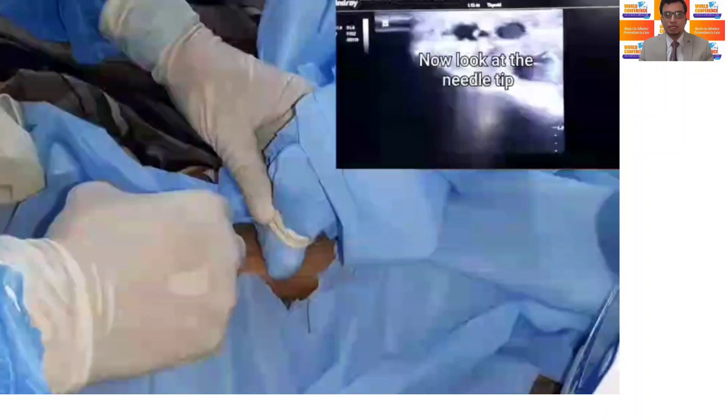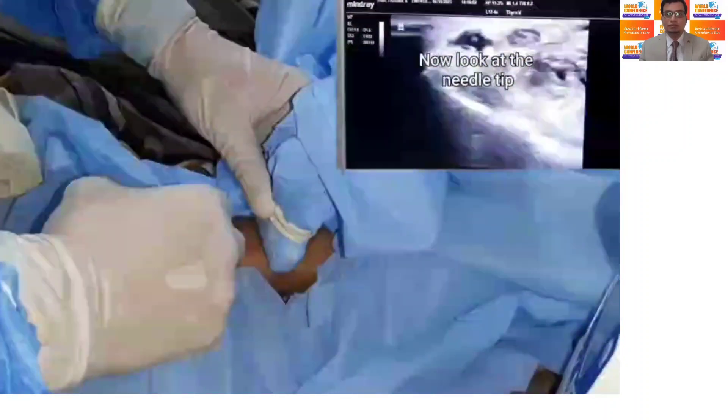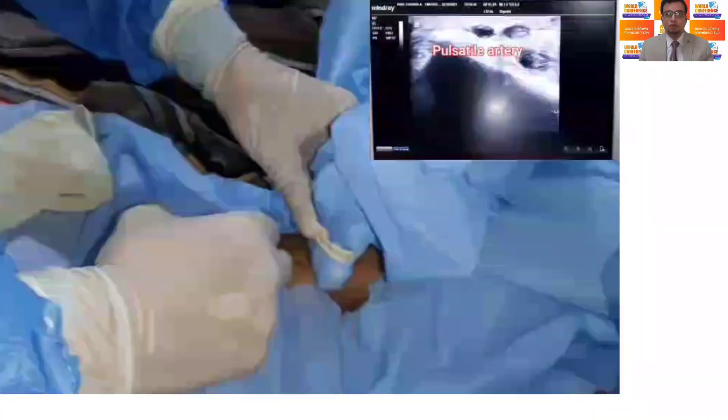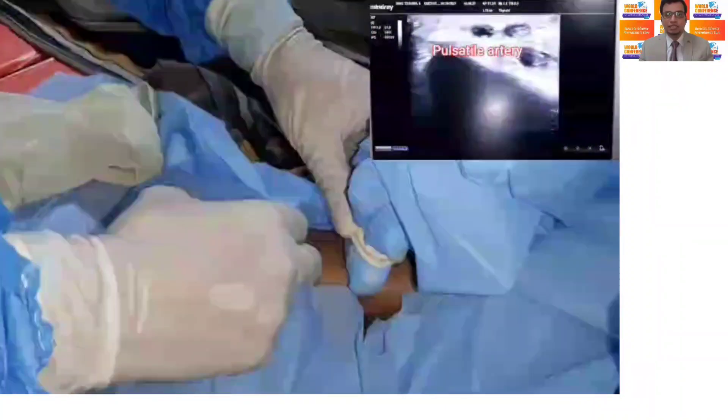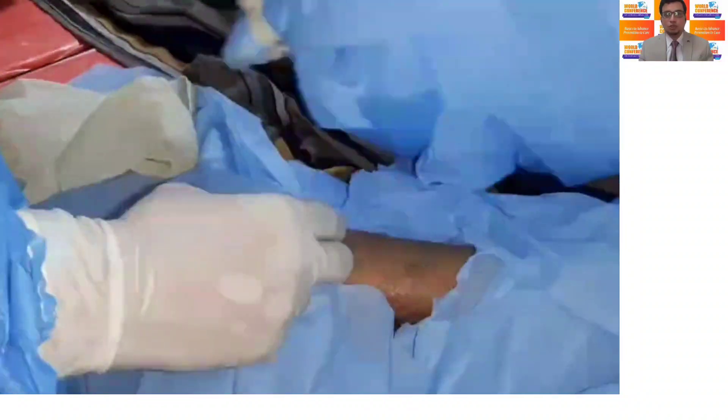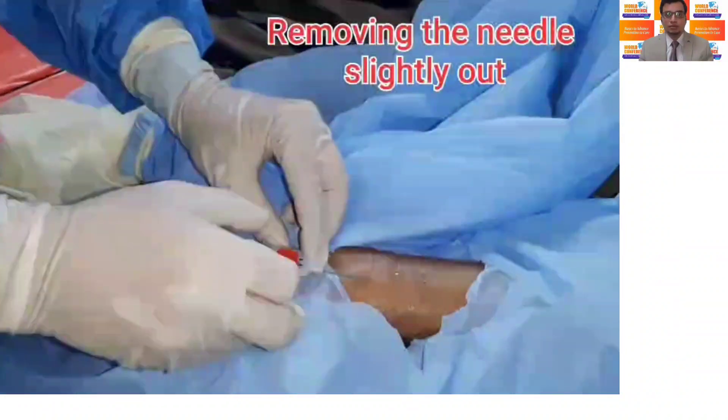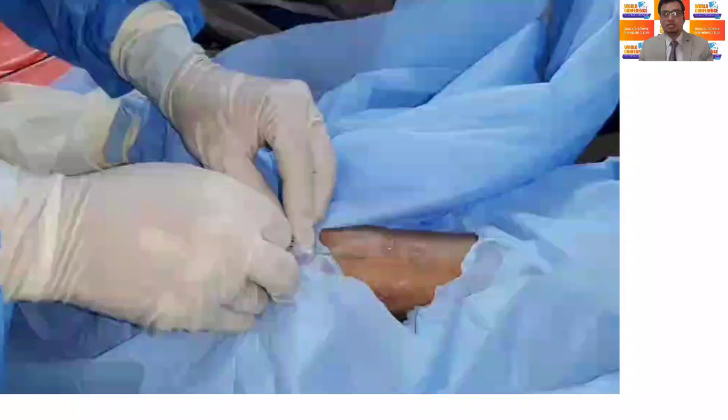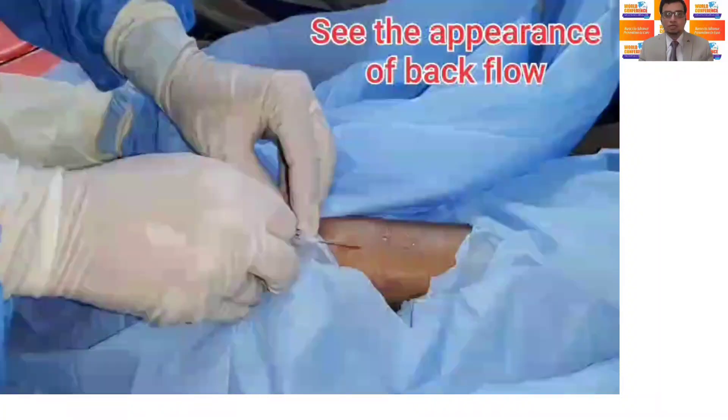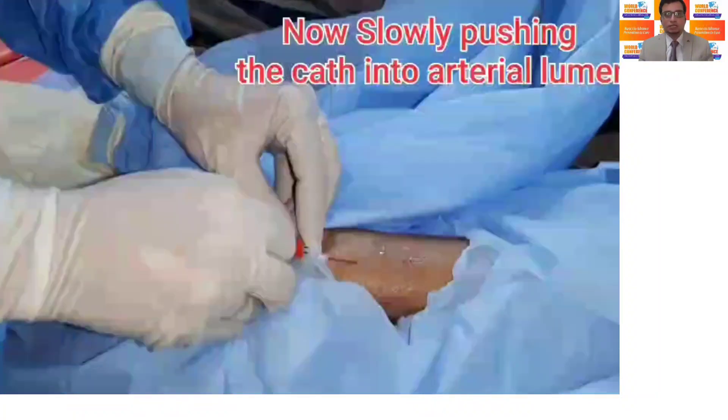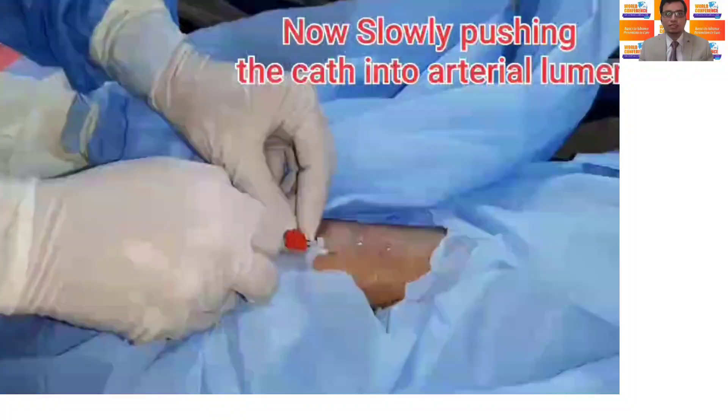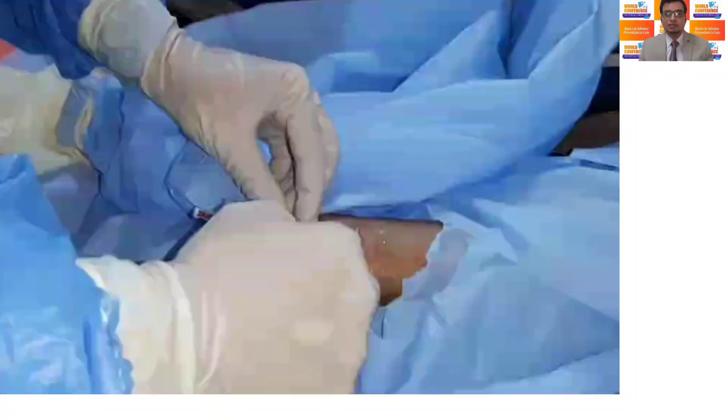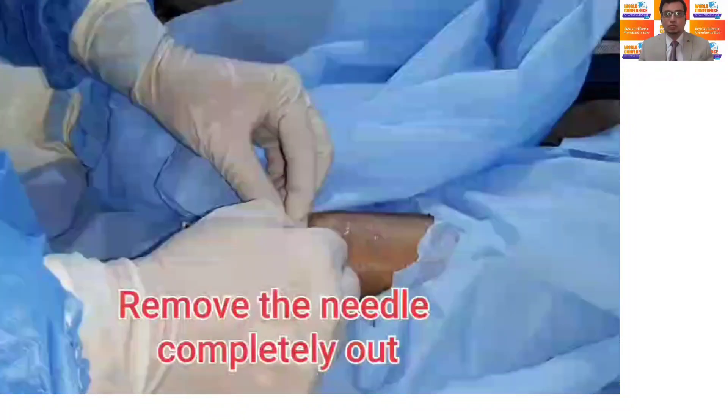Now, the disadvantage is the loss of real-time entry if one is not careful about moving the probe in the direction of the needle entry and may result in through-and-through puncture of the arterial wall, especially the posterior arterial wall, and can lead to posterior wall hemorrhage. The target sign is the endpoint in this technique, when one can see the bright spot inside the lumen of the artery.